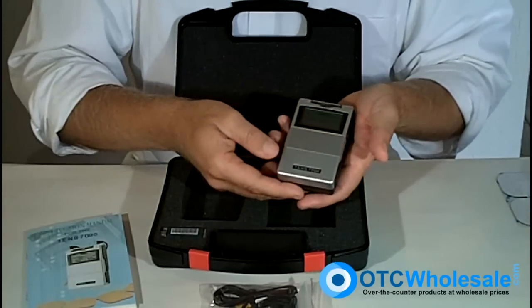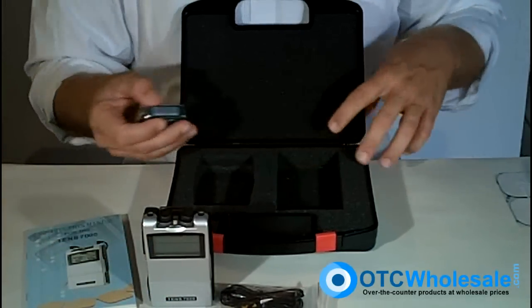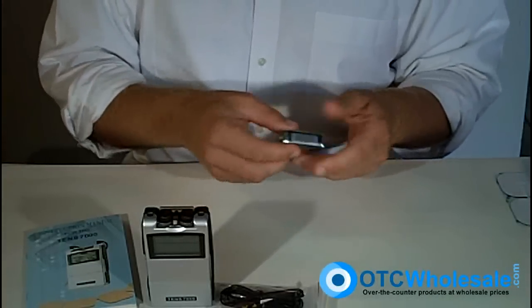This is the unit itself — about the size of the palm of your hand. The TENS 7000 does not use an AC adapter. You're going to need to use a nine-volt battery with it, so I recommend going ahead and getting a rechargeable battery, which we certainly have at OTC Wholesale.